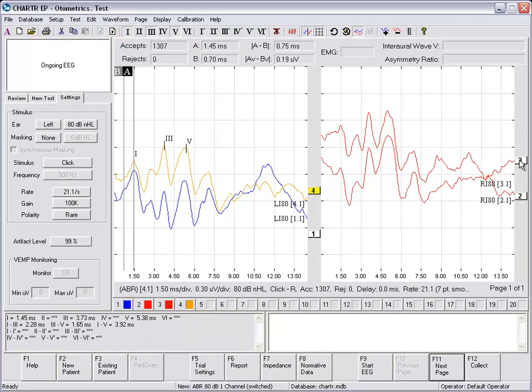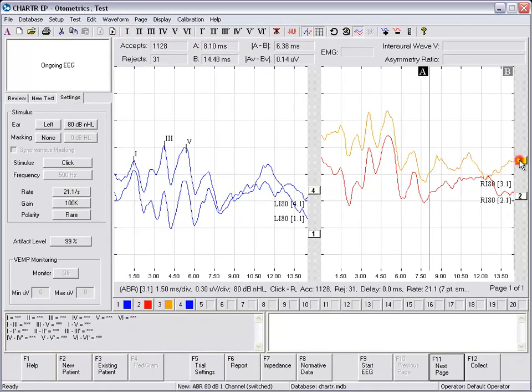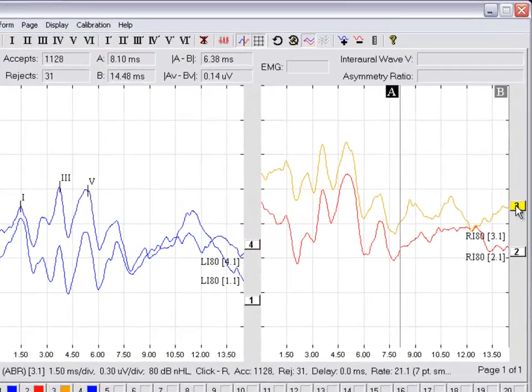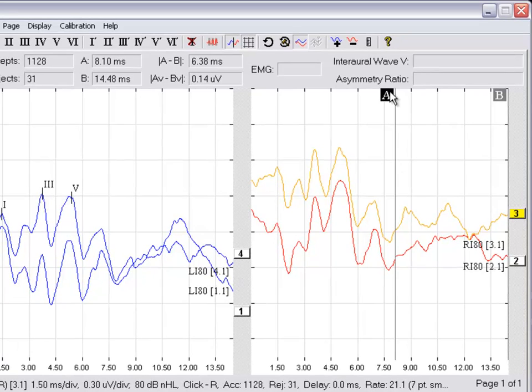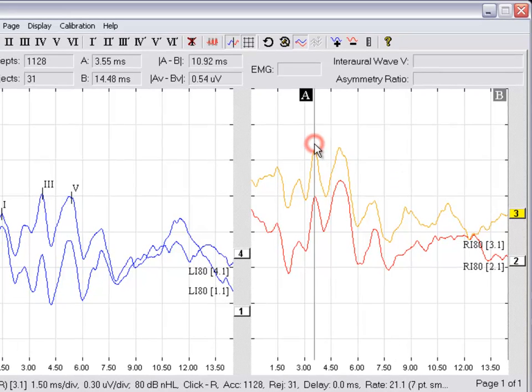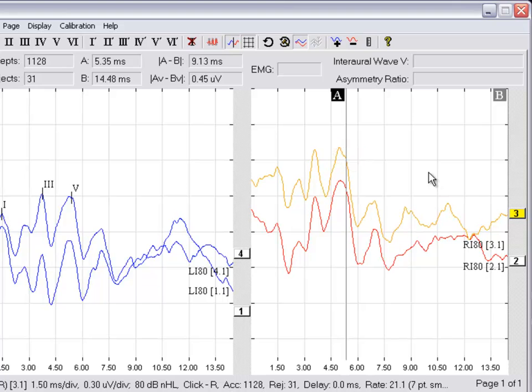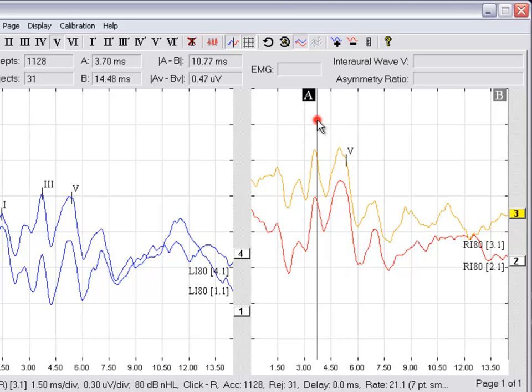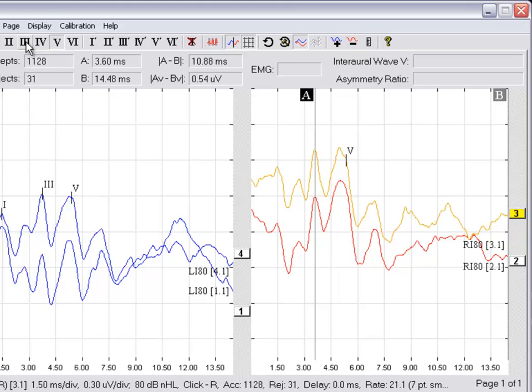To mark another waveform, highlight it, move the cursor to the area that you'd like to mark, choose the marker, move the cursor to the next area, choose the marker.